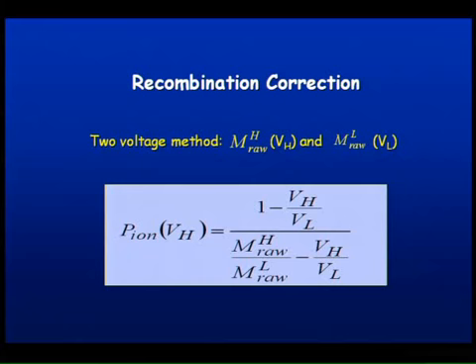The protocol cautions that if you have an ionization chamber that has a p-ion value of greater than 1.05, you should use a different chamber because the uncertainties in the value of p-ion become much larger. And also you shouldn't just try to raise the voltage to reduce the value of p-ion, because the assumptions that are used in the basic theory for the calculation start to break down.